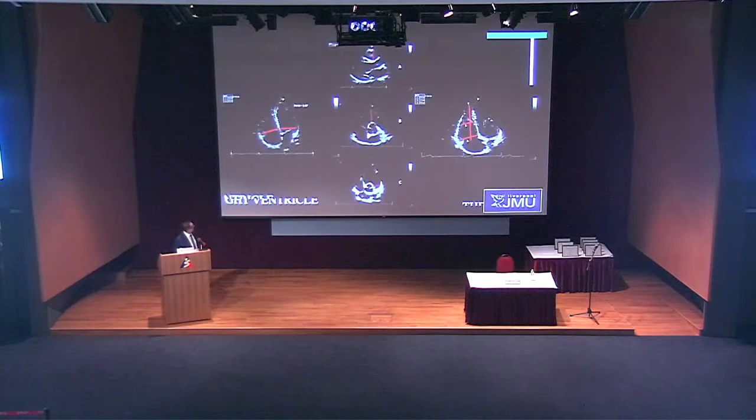Okay, the measurements we're going to make, this is what we would do for a standard conventional. And we did the workshop yesterday. If you think about doing an echo in clinical practice, you don't always interrogate the right side as thoroughly as you should do. In the athlete, it's really important because arrhythmogenic right ventricular cardiomyopathy accounts for anywhere in the literature between 3 and 16% of sudden cardiac death in athletes.